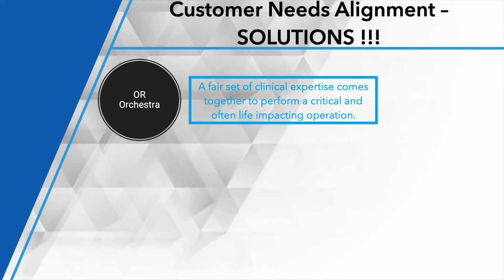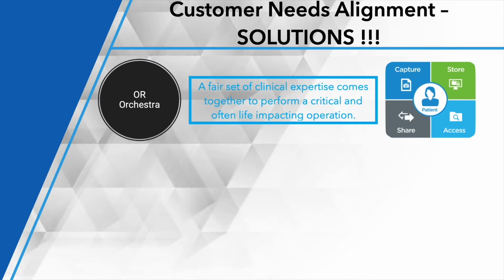So the primary functions are capture, store, share, and access, okay? And it's all centered around a patient. So being vendor neutral is important. A nurse or a clinician is not necessarily a tech expert, right? I mean, everybody understands the difference between a DisplayPort and an HDMI cable. But if you give it to a nurse who is running around with 50 other jobs, trying to plug that cable into the wall will create confusion, create damage in the long run, potentially even bring down an OR. So think of SDVoE as a boon, because it is potentially offering a vendor-neutral solution.